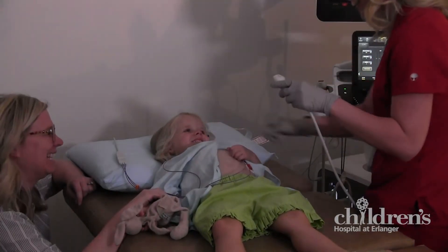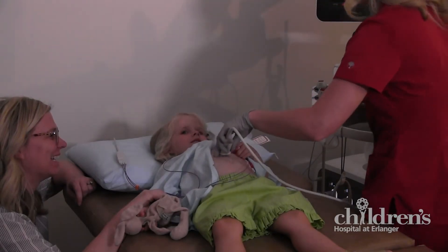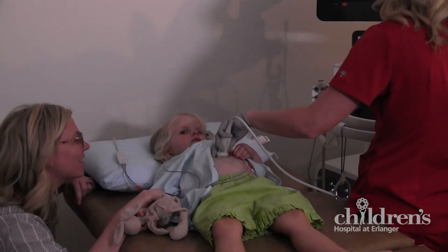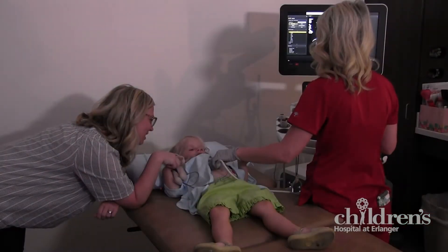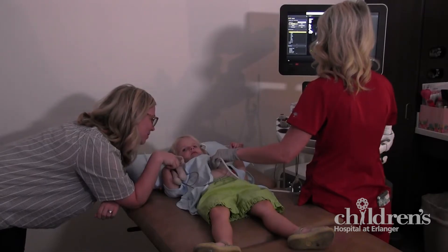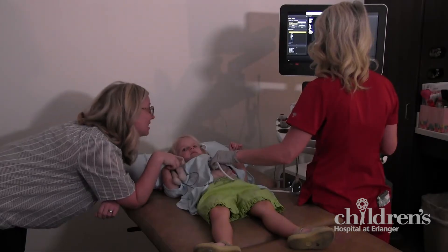The sonographer will then place a transducer, a small microphone-like device, on top of the gel against your skin. This is our camera. The sonographer will move the camera over your chest, abdominal area, and neck. You will feel a little pressure from the camera pushing against you, but it does not hurt.